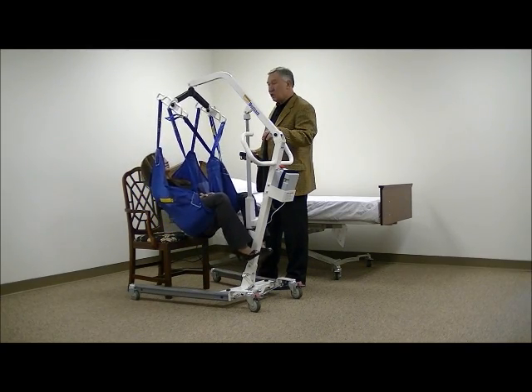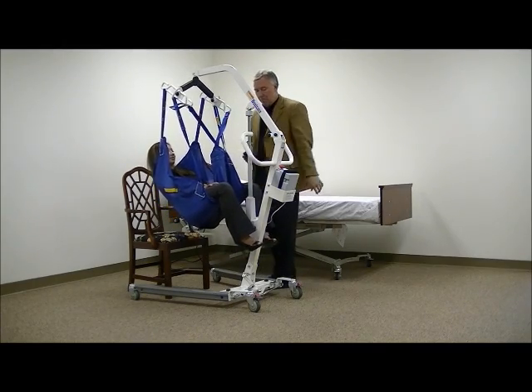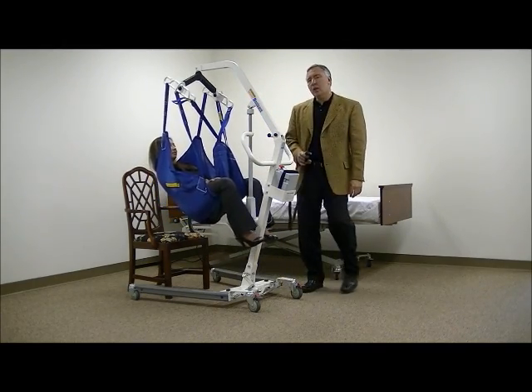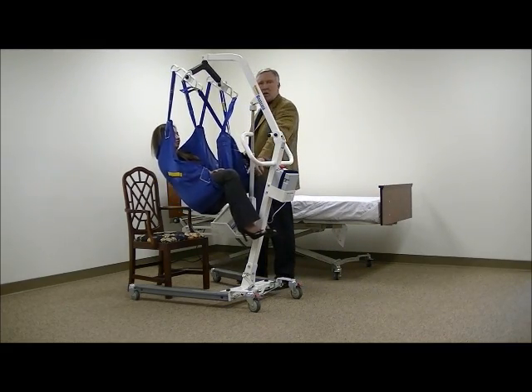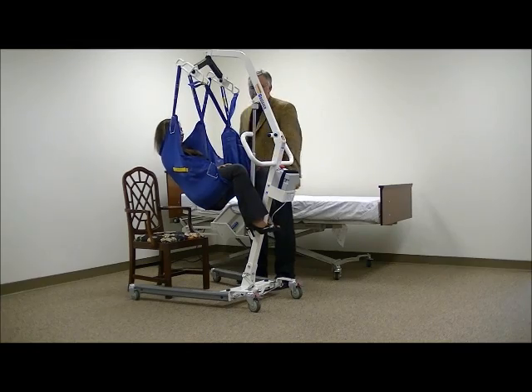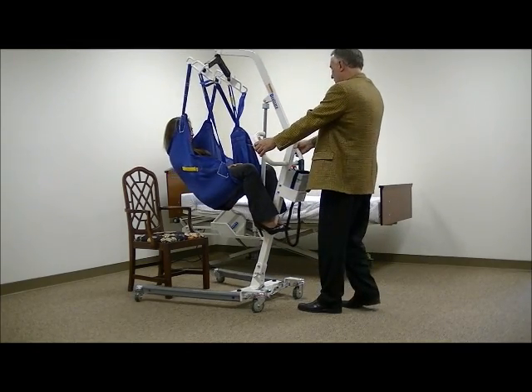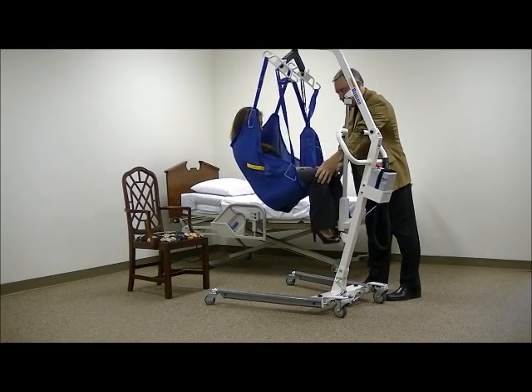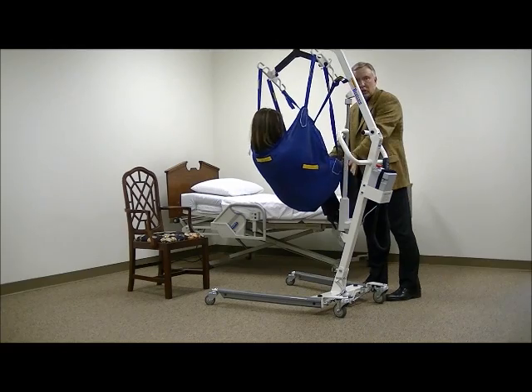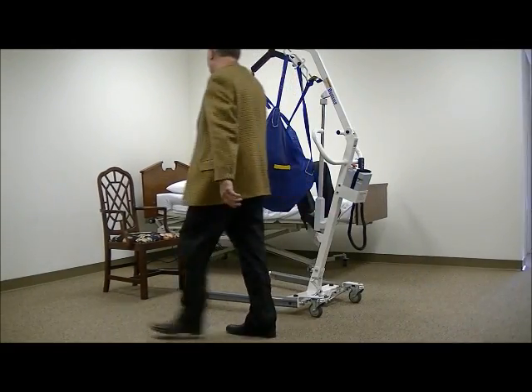You can kind of see that the patient is laying back because of the short here and the long here. But you can also see that with a lift this size, and even someone as small as you are, the legs are all really close to here, which is something you can't avoid with something this small. But it still accomplishes the objective, which is getting you up. You just have to pay more attention to the leg area to make sure that you don't come in contact with the actuator or create any bruising. So now I'm going to transfer this patient into bed.